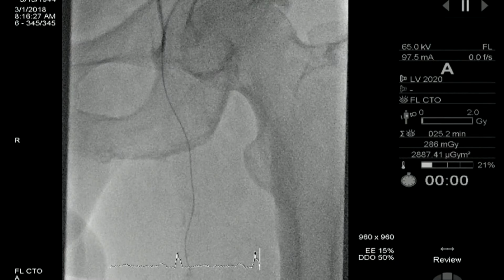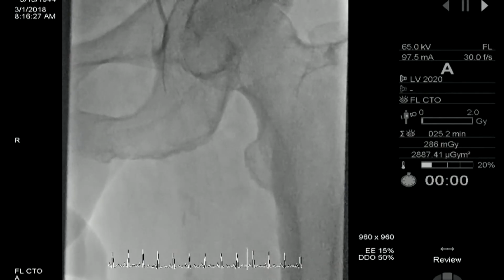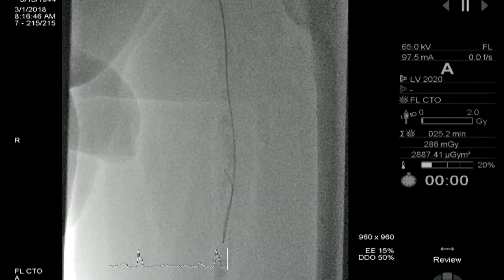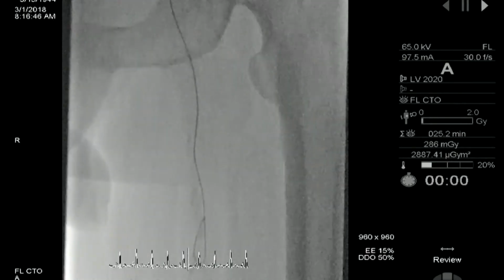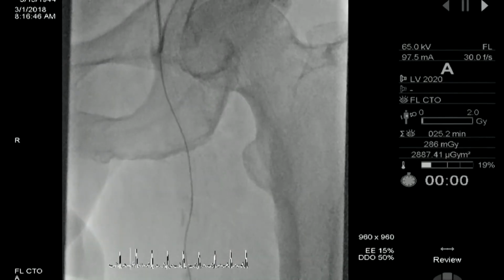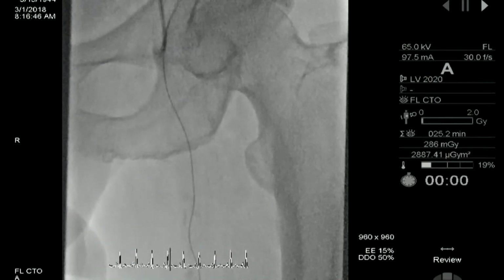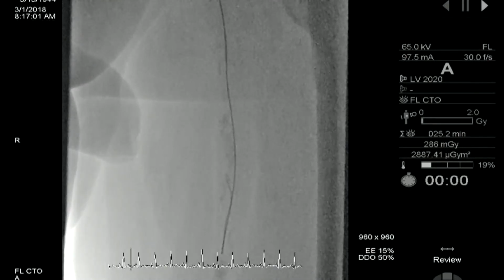Okay, so then we took a wire and we have tried to wire the superficial femoral artery for the total occlusion. Next. And we got the progress of the wire, but you can see it's a calcified lesion and it has gone subintimally, but that is okay, it's going with the loop, and our whole issue here is to get back to the true lumen near the popliteal, because there was no way the wire was going luminally.